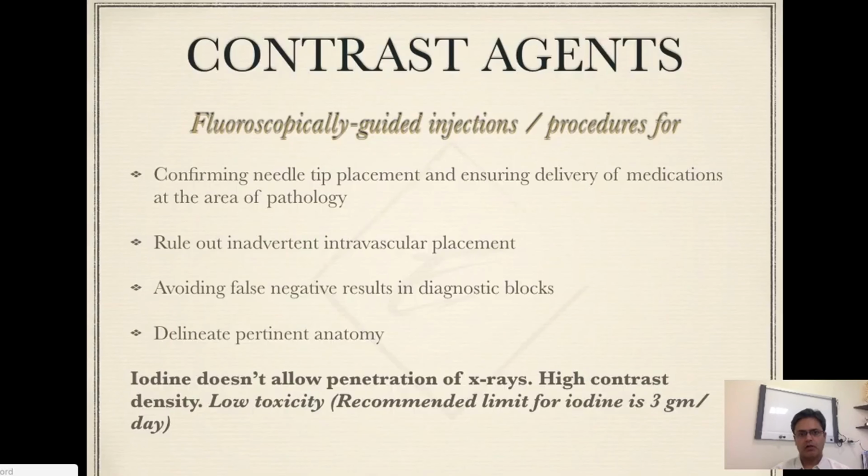So, as we all know the reasons why we use contrast. Common ones being we want to make sure where the needle tip is, we want to make sure that the medications we're giving are delivered in the right area, we want to make sure there's no intravascular uptake, especially if you're doing things like medial branch blocks, where you're giving a very tiny amount of medication. If that's going intravascular, then you will get a false negative result, which is going to have a bearing on your future procedures.